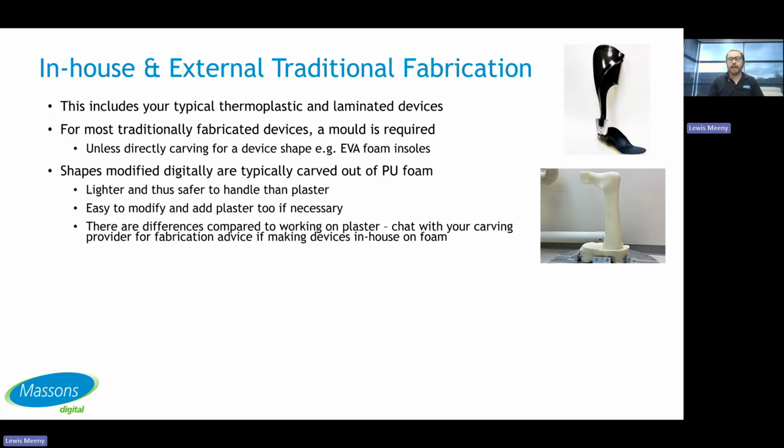It's significantly lighter and safer to handle than plaster. I couldn't even tell you the factor off the top of my head, but the difference is night and day. It's quite easy to modify. You can surform it.